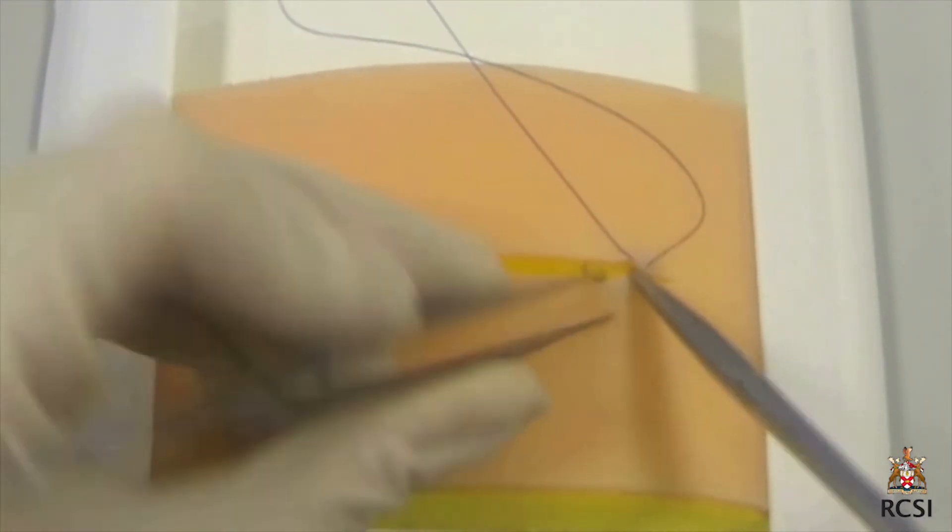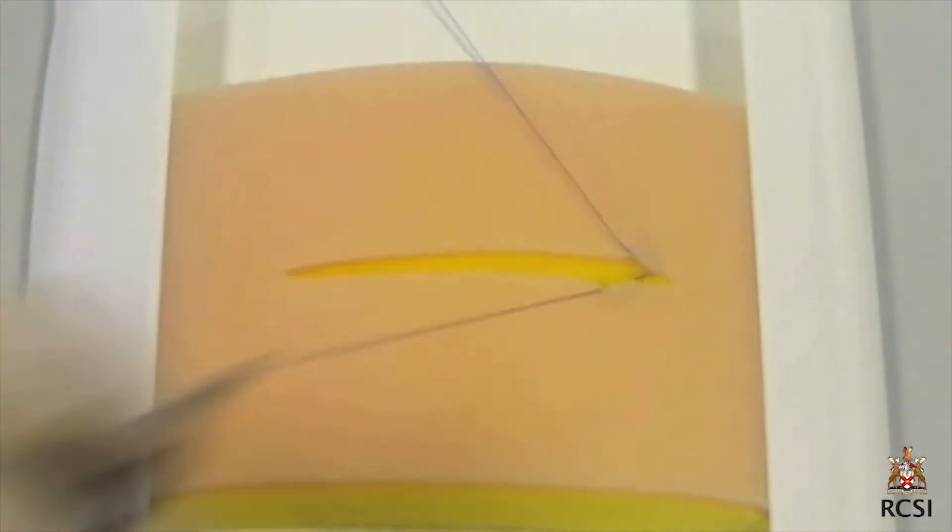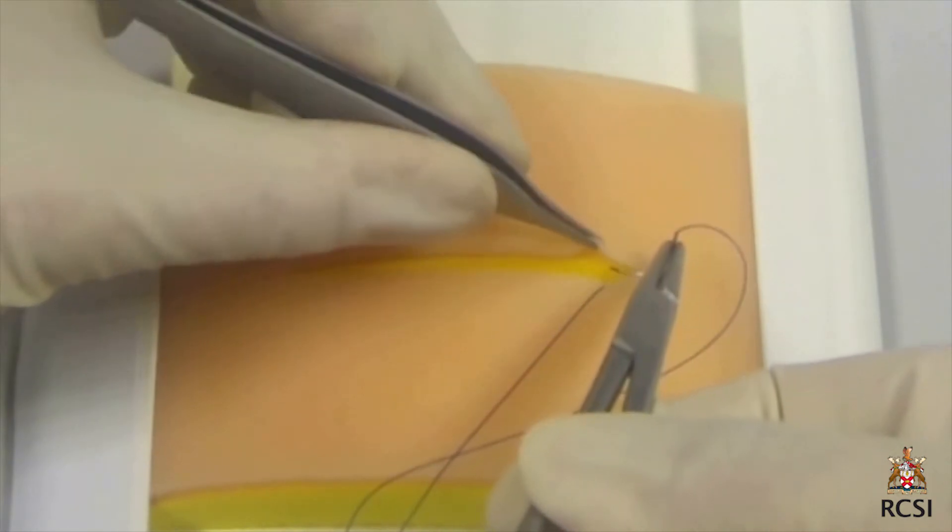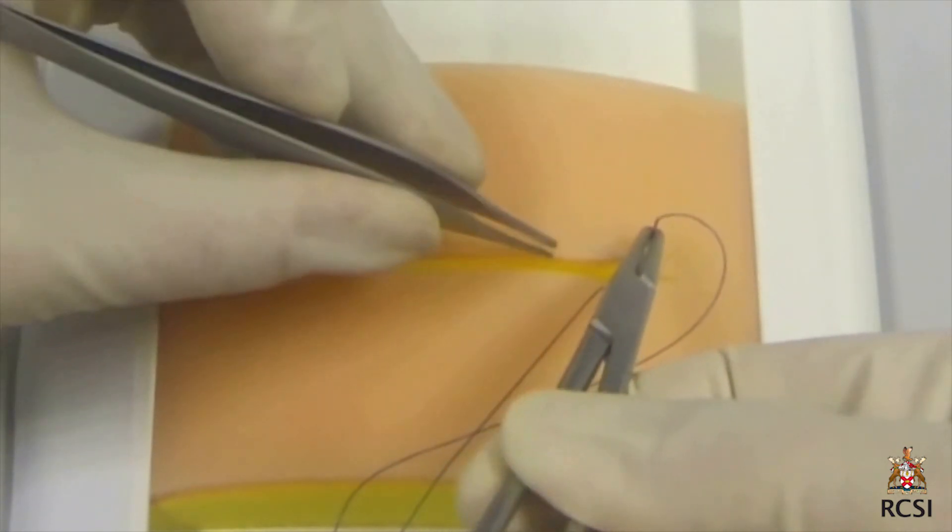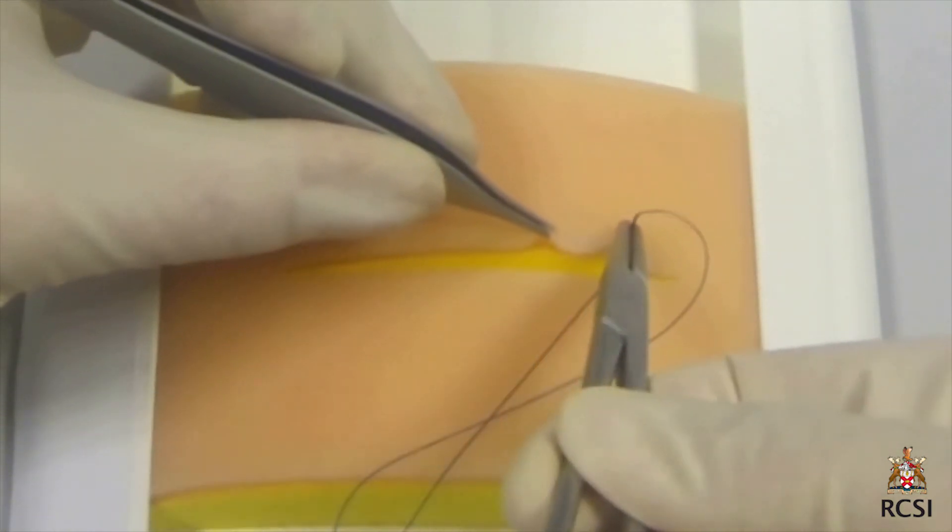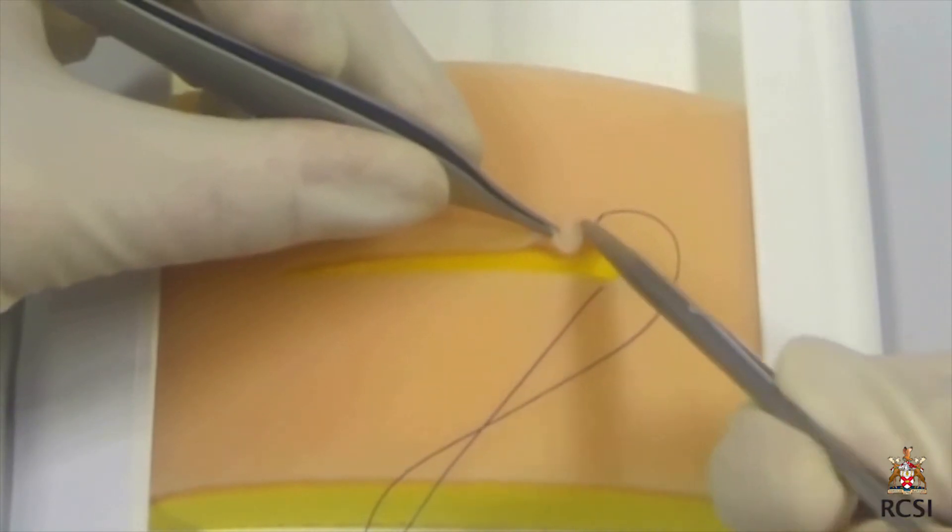Again, the needle is rotated through the dermis for approximately 5mm. Directly opposite this exit point, the next suture is inserted on the other side. This continues along the entire wound.